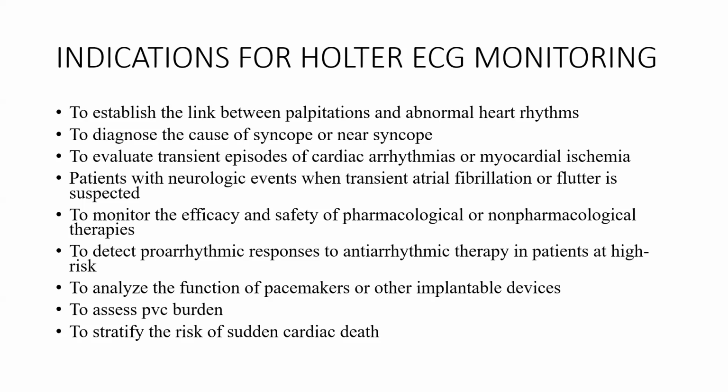Also patients with neurologic events, when transient atrial fibrillation or flutter is suspected, as already mentioned. It's also used to monitor efficacy and safety of pharmacological and non-pharmacological therapy, as well as detect pro-arrhythmic response to anti-arrhythmic therapy in patients at high risk.